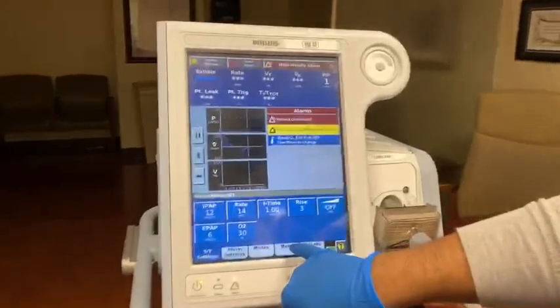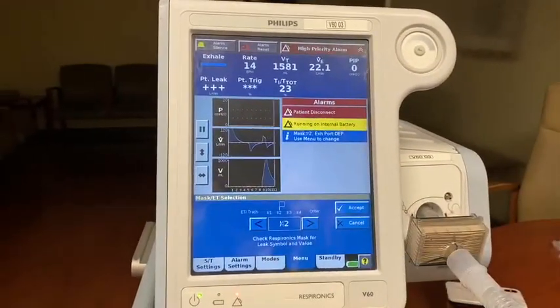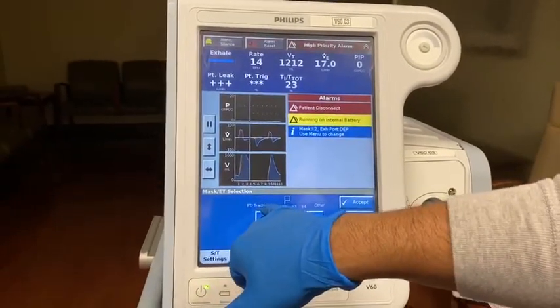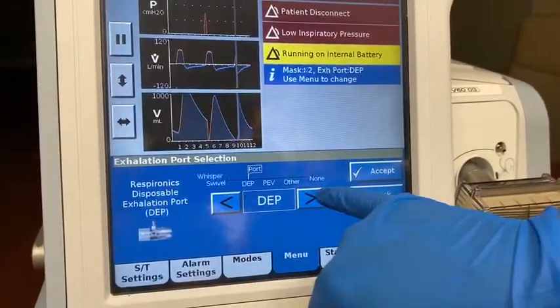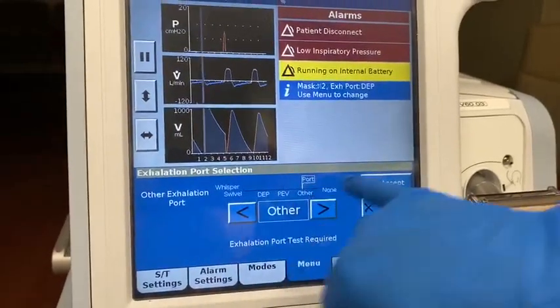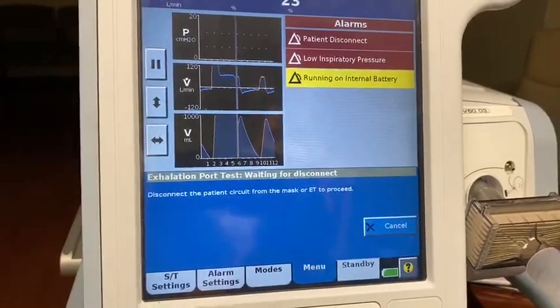Second, we'll be going into our menu. You see the mask and port option — you hit it. Make sure it's very important that you change it to ET/trach setting, which is the first option available. You accept it. Then it takes you to the port section. Make sure it's port other, accept.